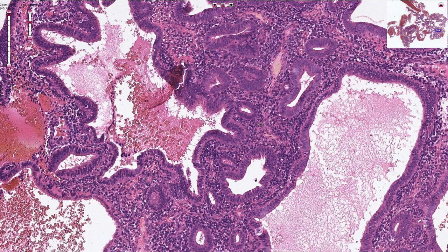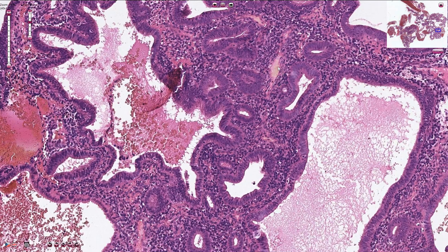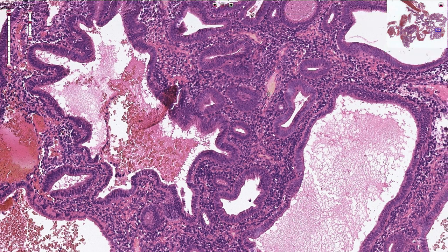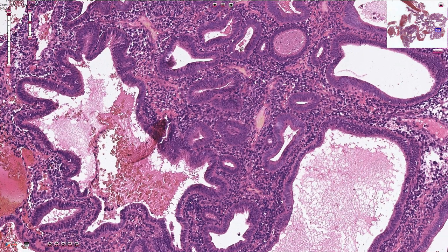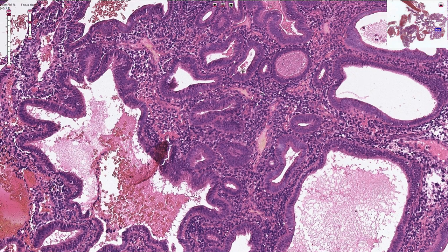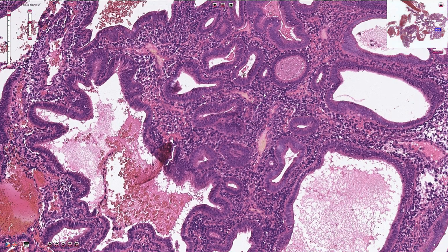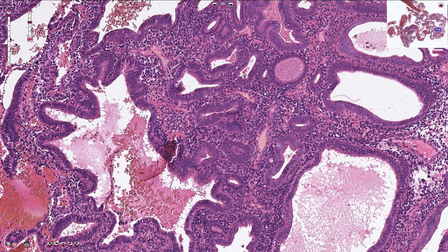Atypical endometrial hyperplasia or EIN — endometrial intra-epithelial neoplasia — needs to be excluded because it is a pre-malignant, precancerous lesion which can progress to endometrial carcinoma.